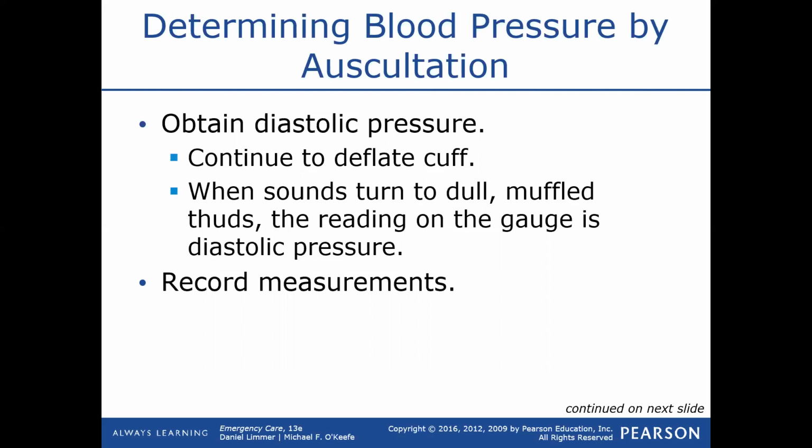So again, I'll just recap. We're going to squeeze the cuff, and we're going to be listening for a pulse. We're going to hear it as we're squeezing. And as soon as you stop hearing it, give it another squeeze or two, and then slowly release the valve. As that air is coming down, you're watching the needle on the gauge. And as soon as you hear the pulse again, that's your top number, okay? Continue listening as the needle comes down. And as soon as you stop hearing the heart rate again, that's your bottom number, okay?